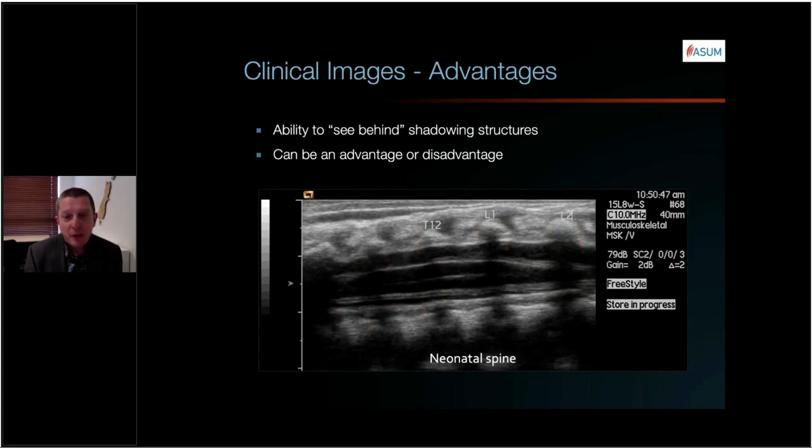However, nowadays, where there will be an acoustic shadow, and you can still see that there are some vague acoustic shadows there, we can also have a window that allows transmission of compounded beams underneath the vertebral body, and therefore nicely outlining the anatomy there. So nowadays it's possible to interrogate the anatomy even in the presence of shadowing.